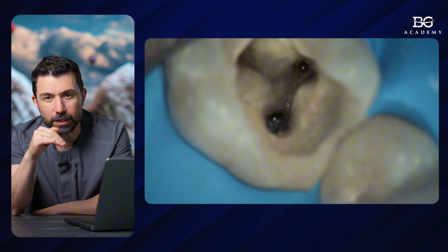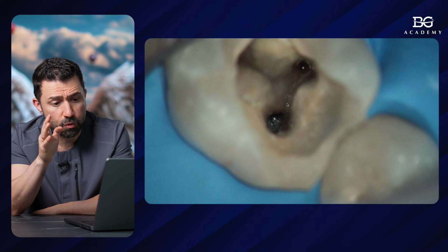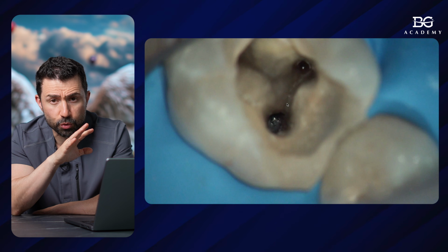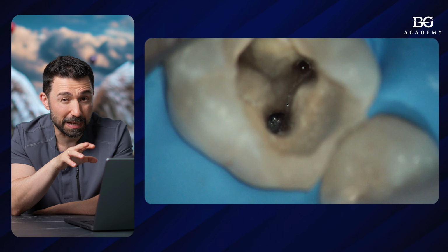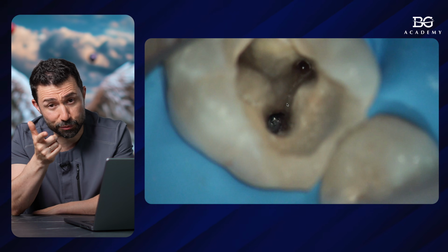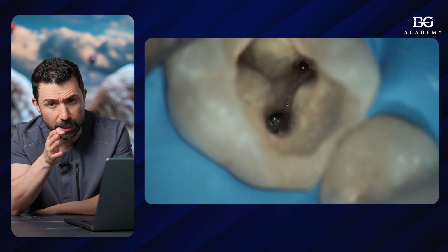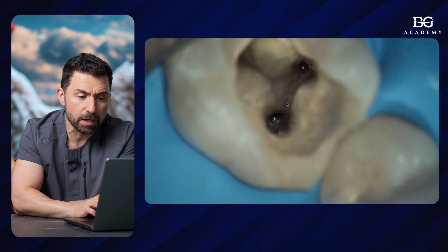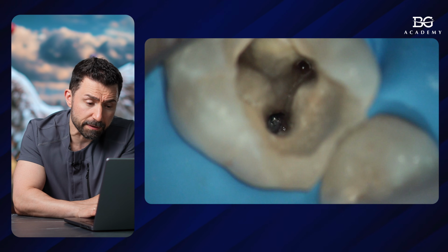So basically you join two canals into one in the coronal part, but you have to move your burs and your instruments from buccal to lingual, following the isthmus. Otherwise, if you do your preparation from mesial to distal, then you will have a perforation. So we do it from buccal to lingual, following the isthmus with the thin instruments. You can see here when the isthmus was already instrumented, and I was able to see the fragment.